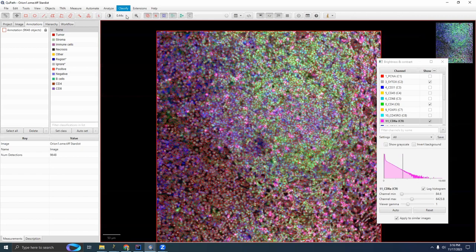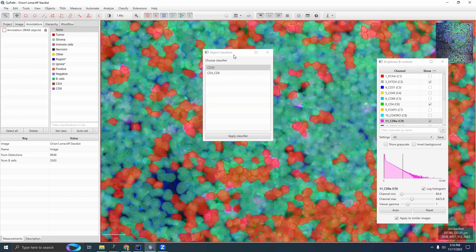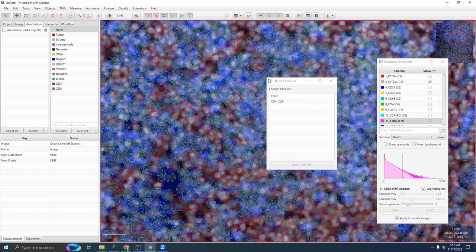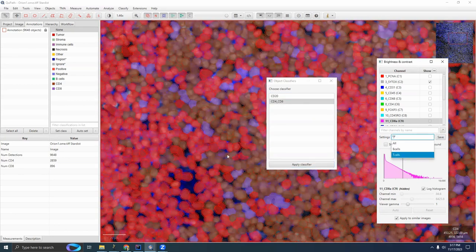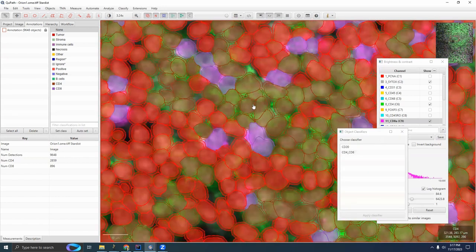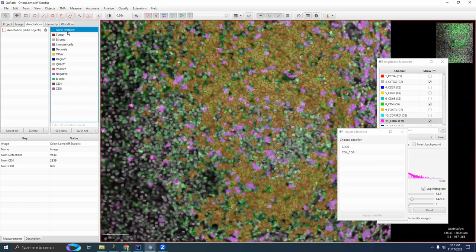I also already made a CD20 classifier for B cells. And if we just look at the B cells here, you can see it does a pretty reasonable job of finding the B cells. And separately, I made a classifier that does CD4 and CD8 cells, which we could apply here. Classifier, and switch to the T cells. And again, it does a pretty good job. The CD4 cells are in dark red, the CD8 cells are in pink, and the red cells are the neither, which we can hide like that. And so a good enough job given that I spent all of 3 minutes on it.